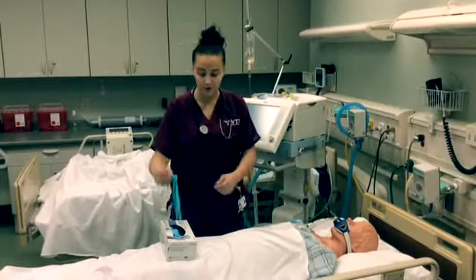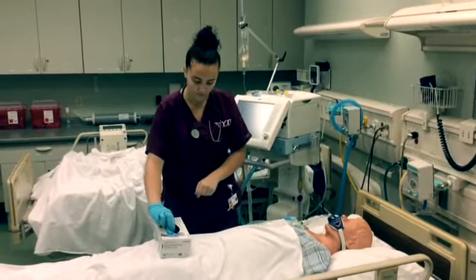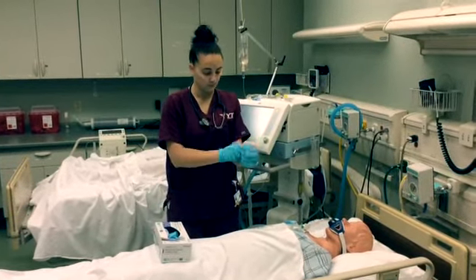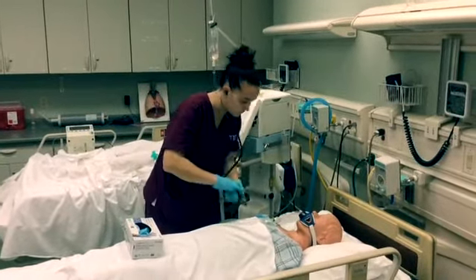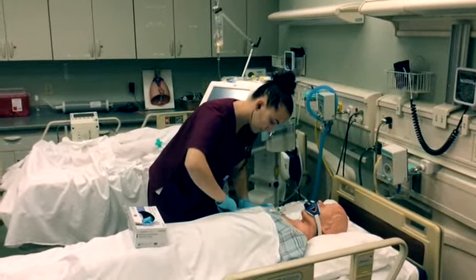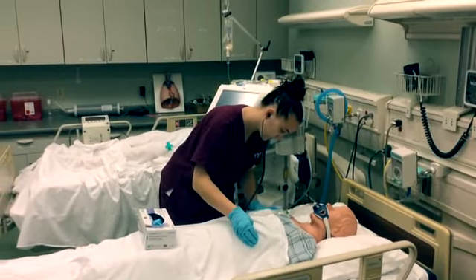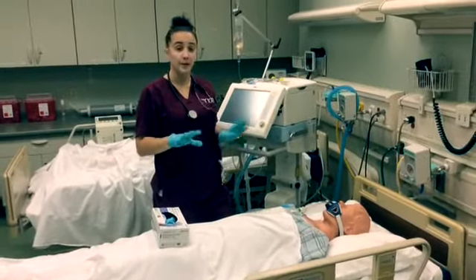To start, we're going to put our disposable gloves on, our clean gloves. We're going to assess our patient. We're going to make sure that we have everything that we need.